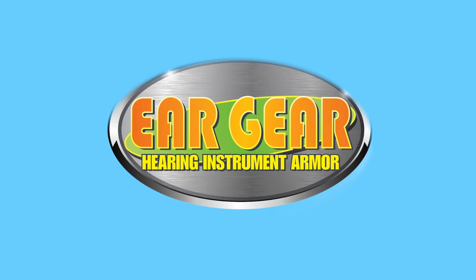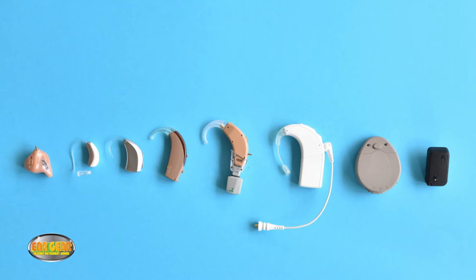Eargear is protection for your hearing instruments. No matter what type of hearing instrument you have, Eargear can protect it. Whether your hearing instrument is an in-the-ear or behind-the-ear hearing aid, a cochlear, rondo or baja implant, Eargear protects them all.